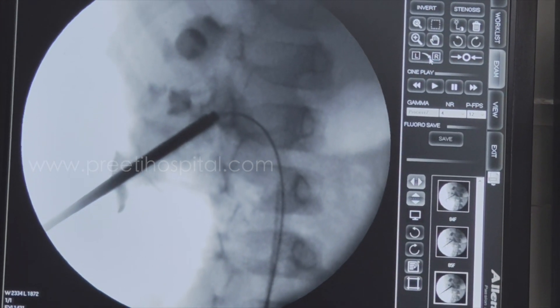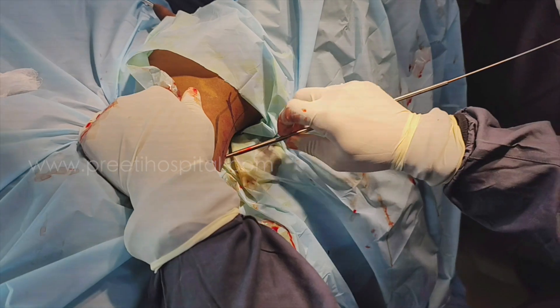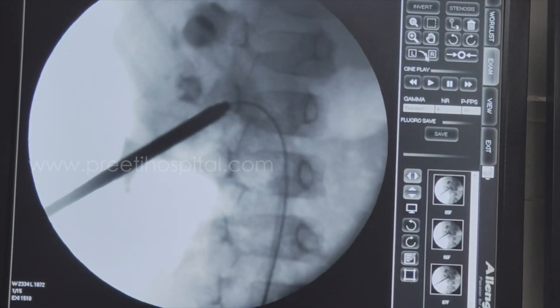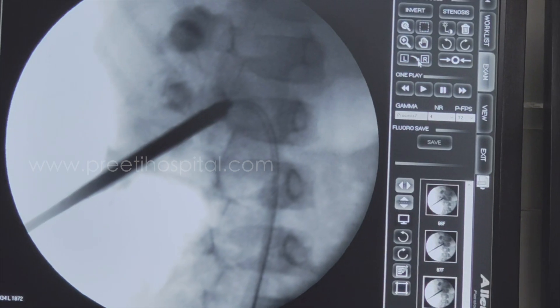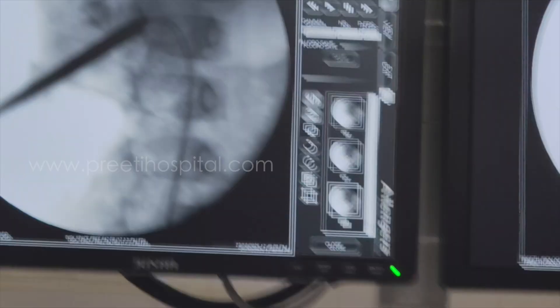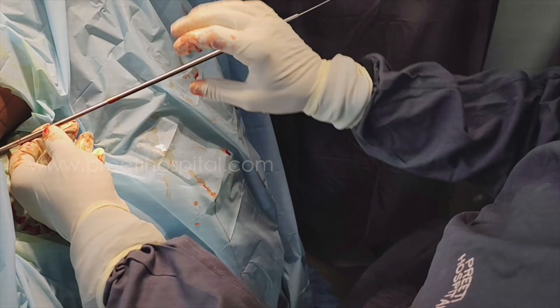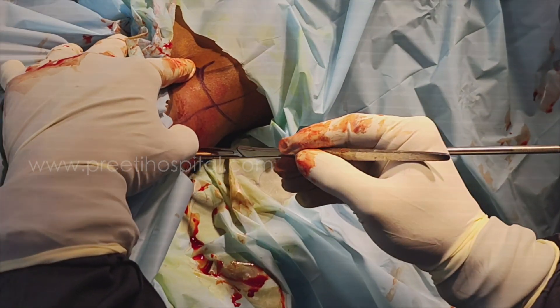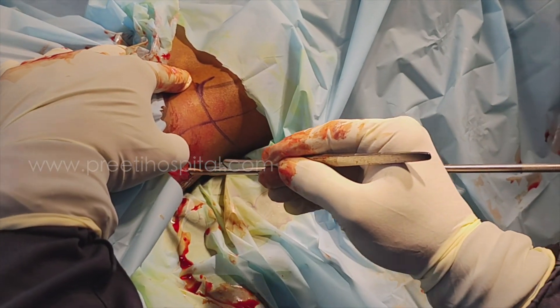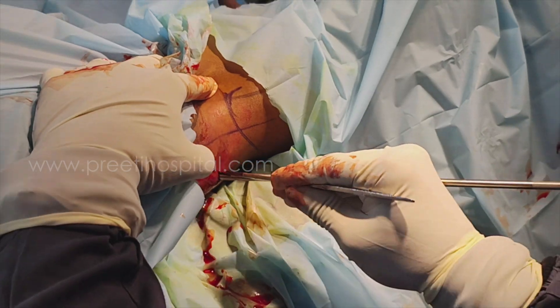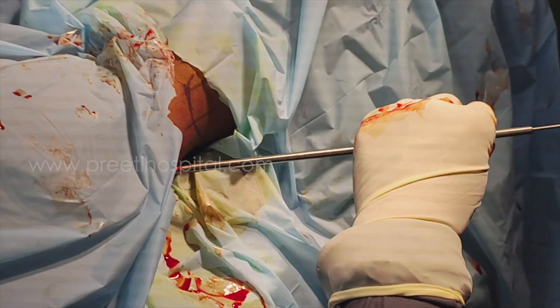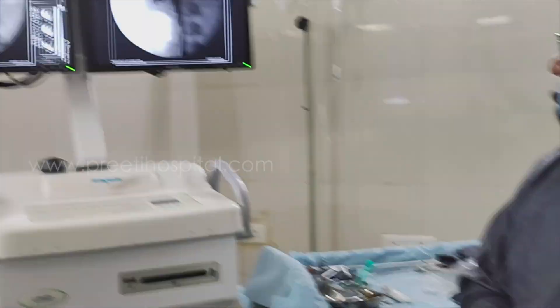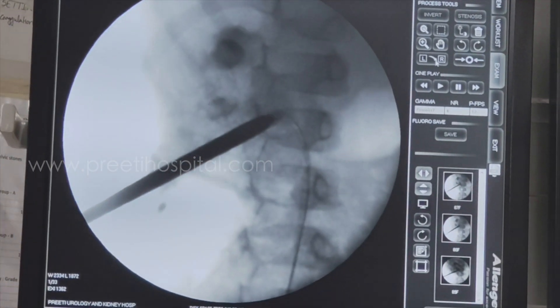This is very very important — sometimes the dilator goes deep into the kidney, so you should be very careful. He is suggesting 18 French is better. Always remember: cut the skin. Without cutting the skin — putting dilators is like a laparoscopic port without cutting dermis — you apply more force, more thrust. Then see how much it has gone medially. You should not go too medially — this is dangerous.